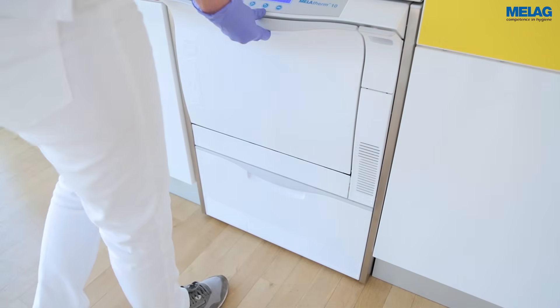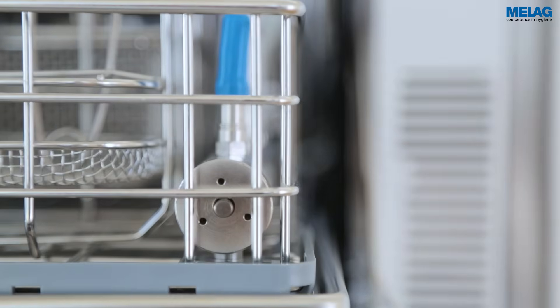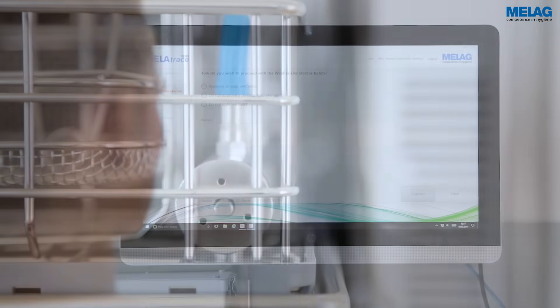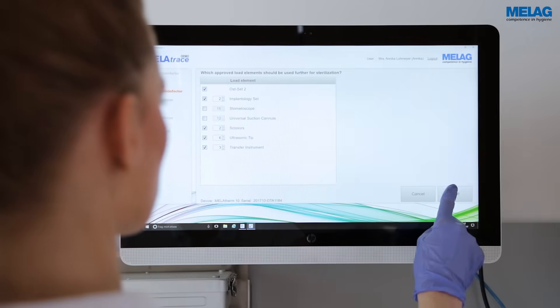The control display of the central filter enables direct verification of the decontamination of the hollow instruments. The operator can perform a visual check of the cleaning result, which is documented with MeLaTrace.